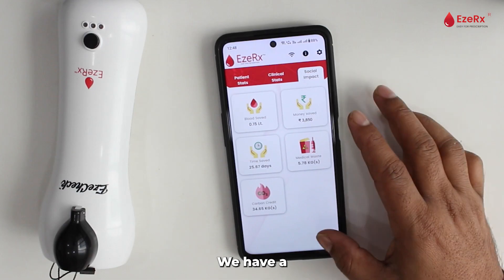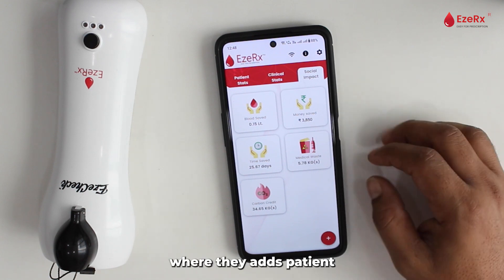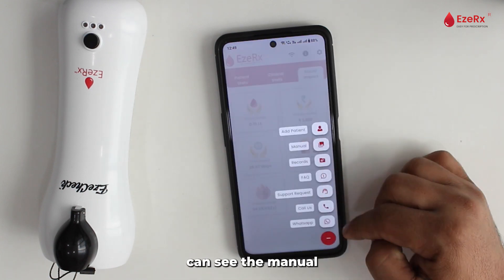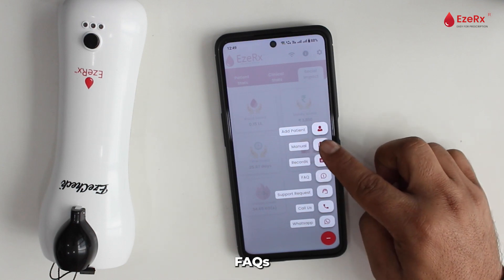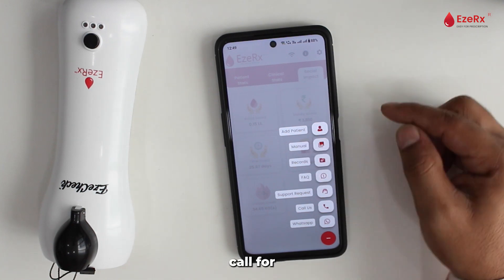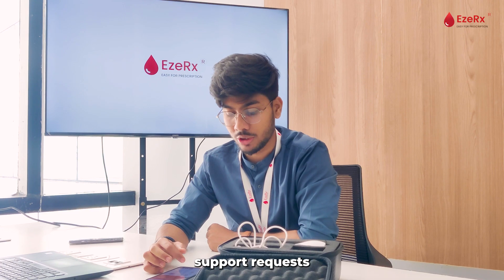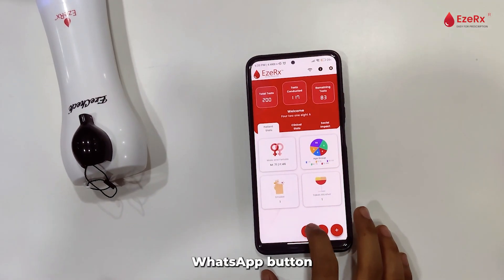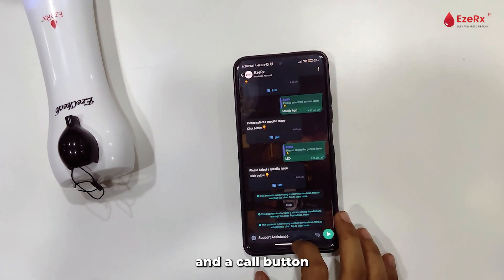At the bottom, we have a plus icon where I can add a patient, view the manual, see records, see FAQs, and also call for a support request. The support request can also be accessed through the WhatsApp button and the call button.